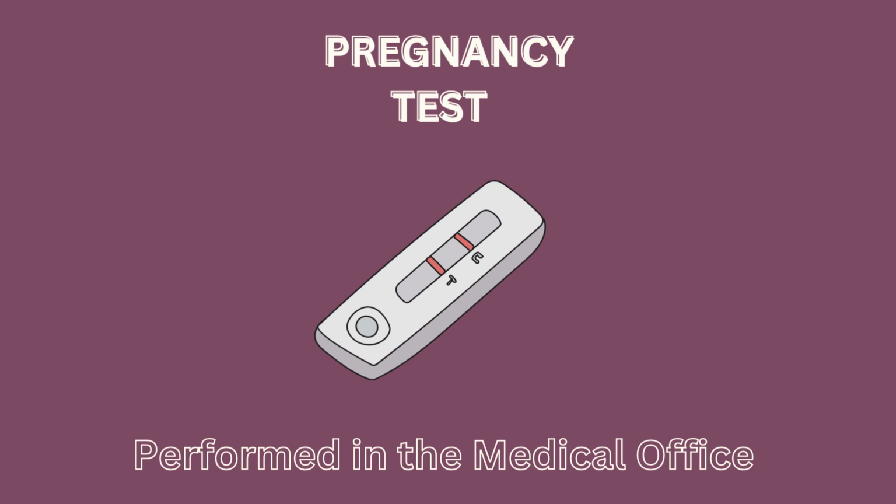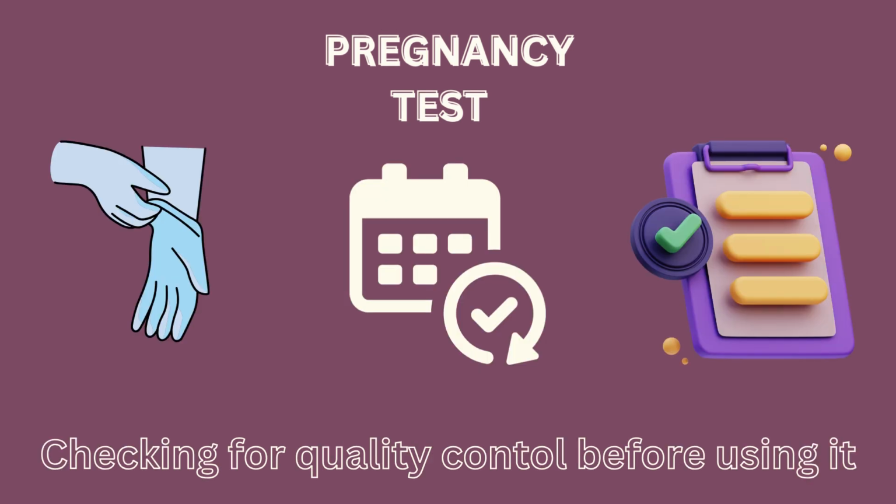Before performing the pregnancy test, medical assistants should wear gloves and first check the quality control of the kit she has in hand. After the quality control has passed the test and is up to date, she will go ahead and use the kit.